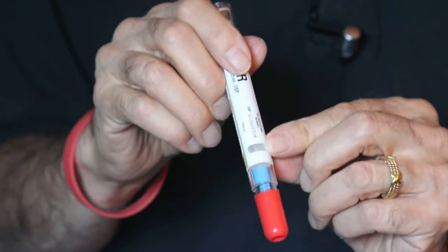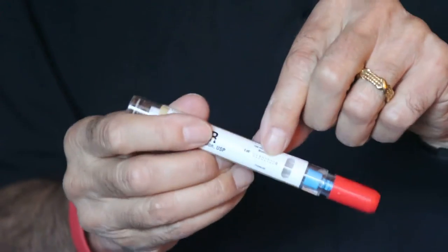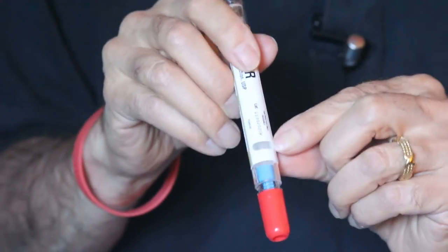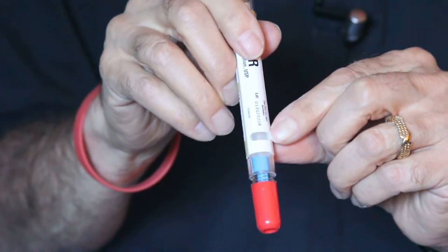Also, before you inject — and you should always, with medications — check the expiration date. With this one, you're going to look here. If this medication is cloudy, that's telling you that the pen has been infiltrated and you don't want to use this medication.